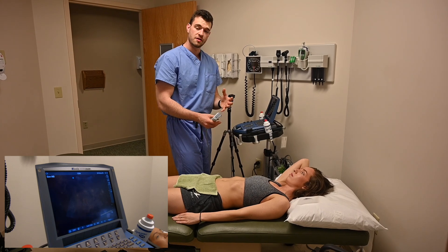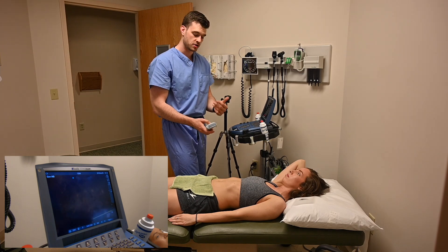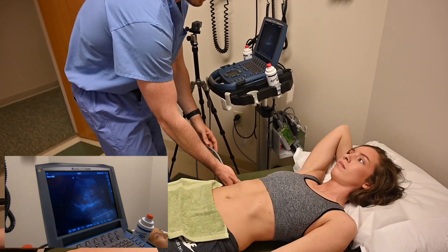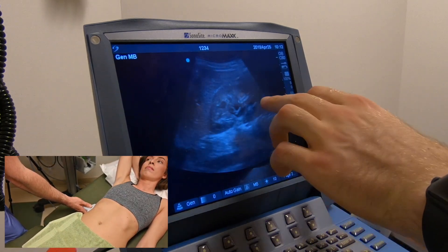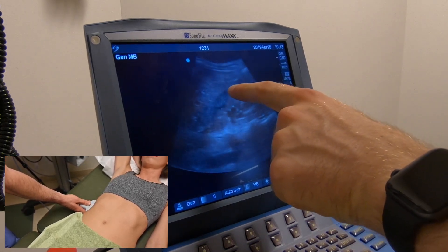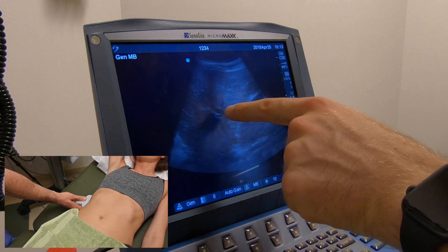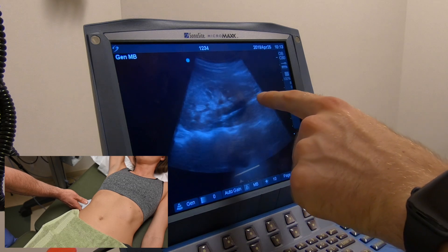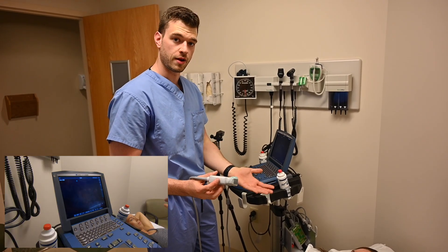We'll start the E-FAST exam with Morrison's pouch — the interface between the liver and the kidney on the patient's right side. I like to hold the probe with my hand on the bottom for this view. We can see the kidney with the calyces and renal pelvis, and the liver beside it. The motion used here is called fanning — I'm fanning through the kidney and watching the border between the liver and the kidney. A black stripe there would indicate fluid. We can see some hepatic vasculature in the liver, and the kidney all looks very healthy. No fluid — this portion of the exam is negative. My personal order is right side, then left side.